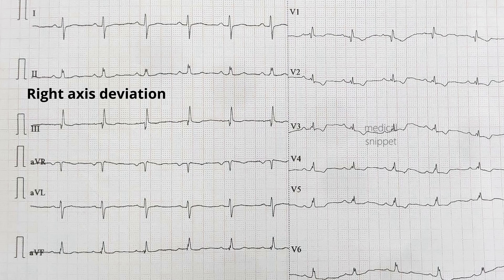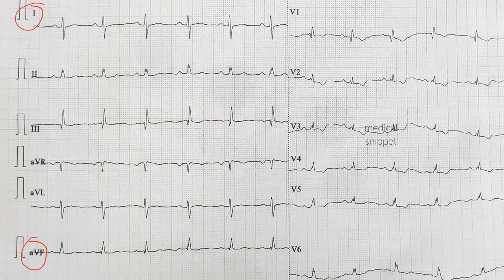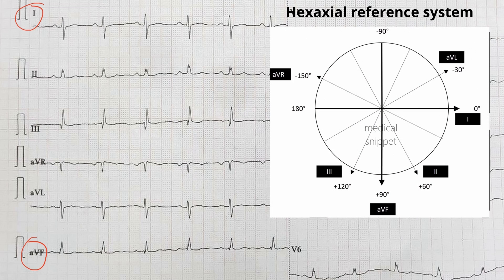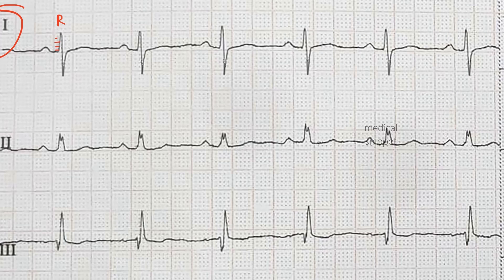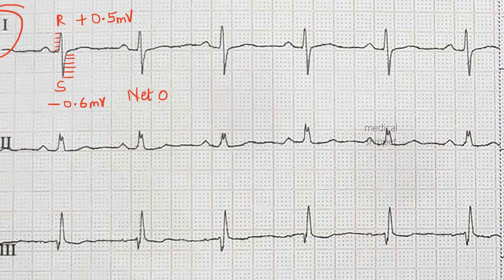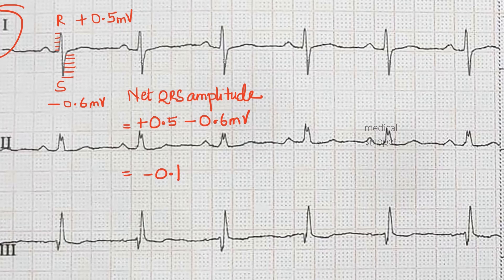There is right axis deviation. To calculate axis we have to look at QRS complexes in lead 1 and AVF. Let's plot the net QRS amplitude in the hex axial reference system. In lead 1 the R wave amplitude is five small boxes, that is positive 0.5 millivolt. The amplitude of S wave in lead 1 is six small boxes, that is minus 0.6 millivolt. So the net amplitude is minus 0.1 millivolt. Let's plot it in the hex axial reference diagram.